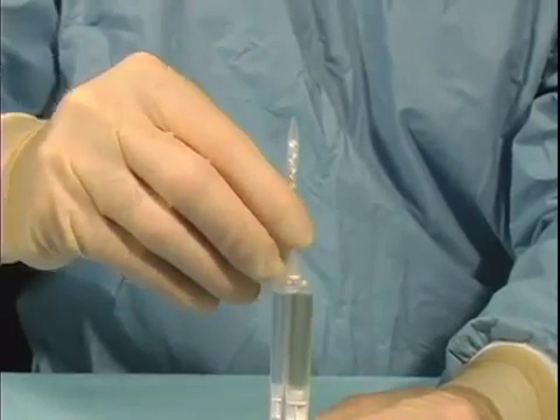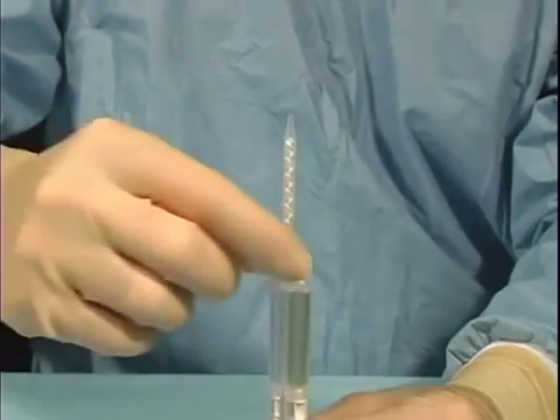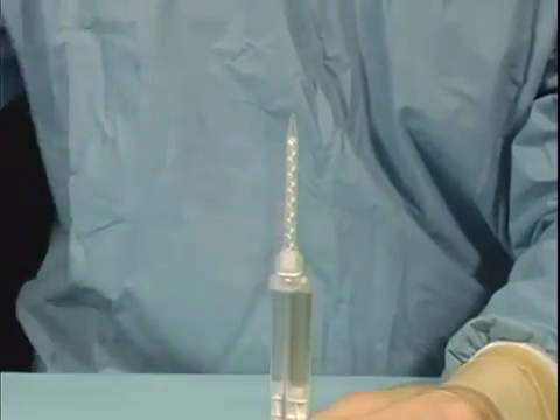Again, it is important for the surgeon to prime the tip immediately prior to application.